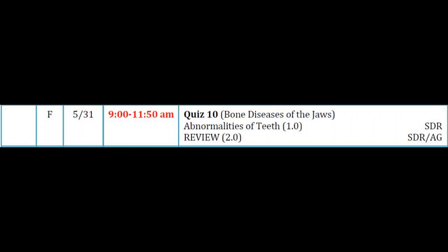Number 5. This was our third one. So first of all, what is the radiographic character of the lesion? Is it lucent, opaque, or mixed? Mixed. It's part lucent, part opaque, and the opacities are uniformly distributed throughout. He's a 36-year-old. It's gradually been expanding. It's well-defined. It's a solitary lesion. That all fits with a benign process.